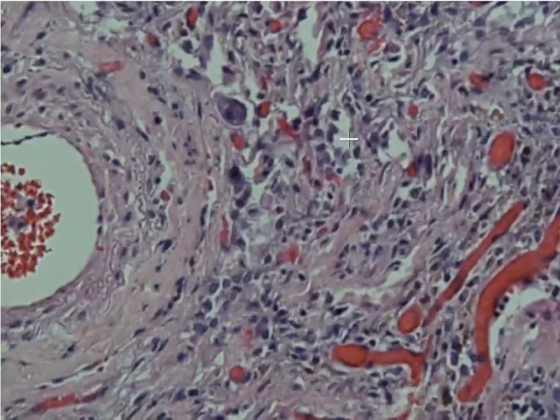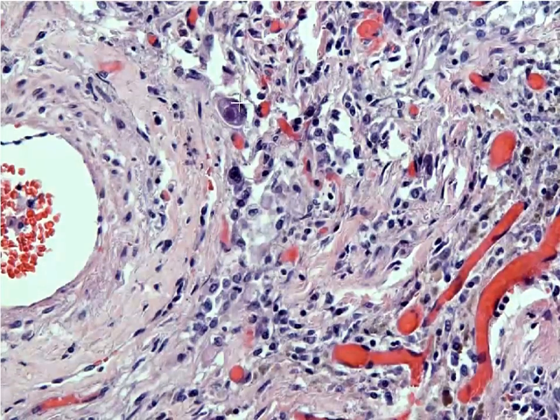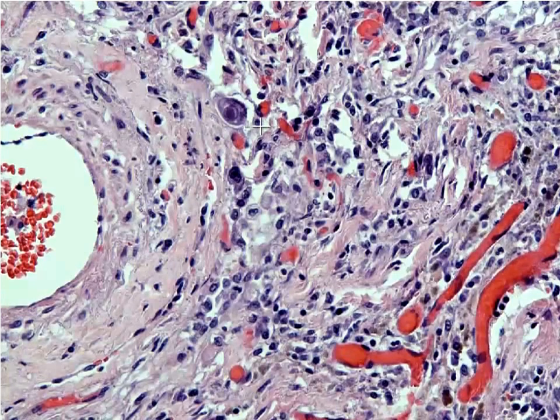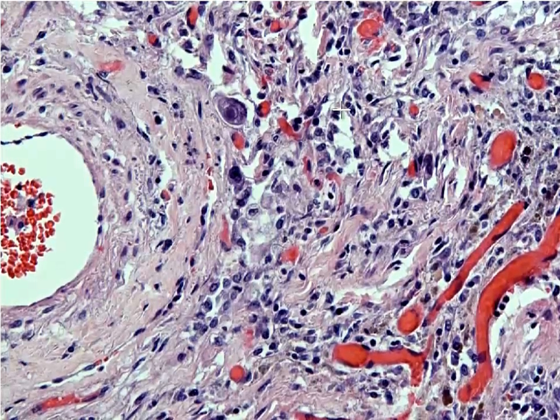And we know that because we can actually see the viral inclusions within some of the infected cells. And so this is actually a CMV inclusion. We know it's CMV because it is both nuclear and cytoplasmic. So you can see purple dots in the cytoplasm and a large glassy nuclear inclusion there next to that large blood vessel.